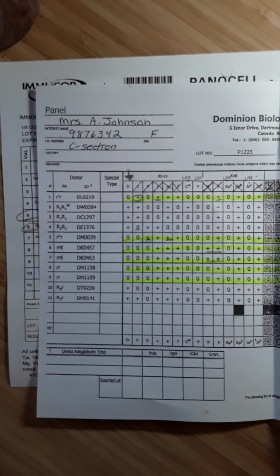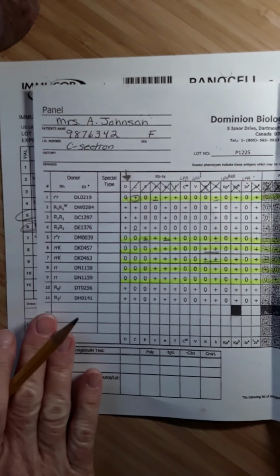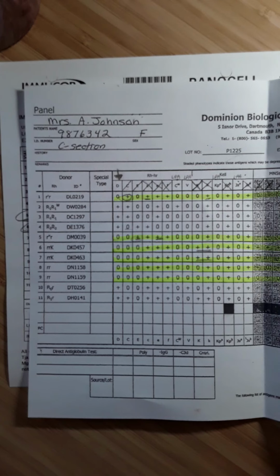Luckily, there is a caveat to the rules, and that's over on page 10 in your module. So if you look on page 10, at the top of the page, Roman numeral number 3, there's a note. When an anti-D is identified, the big C and big E can be eliminated using 2 heterozygous cells. Now that is actually not just a SAIT rule. That's a very common rule used in most labs, as it's really quite difficult to find a D negative cell that is homozygous positive for big C and or big E. So take a look at a panel sheet to see what I mean by that. It's just very difficult to find.